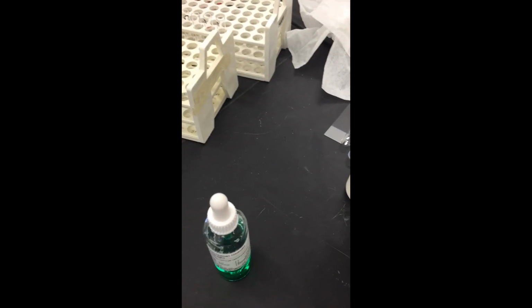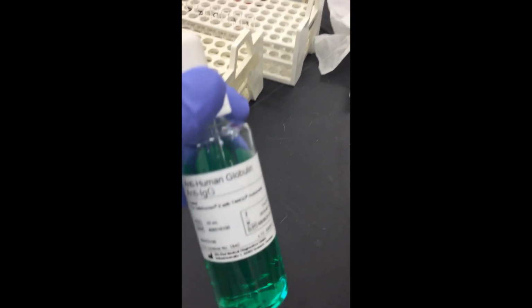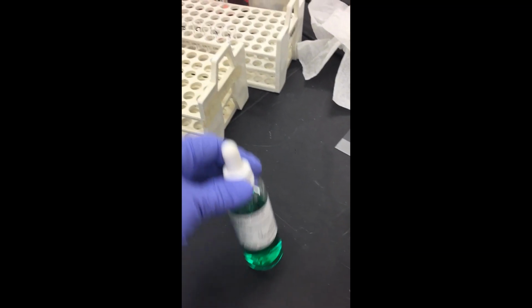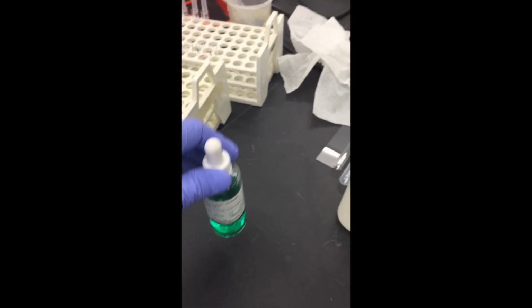Okay, so we read the tubes after 37-degree incubation, and then I washed them 3 times and created a dry cell button, added 2 drops of anti-IgG, and spun them again, and now we're going to read them. This you will place under the AHG, anti-human globulin, part of your worksheet.